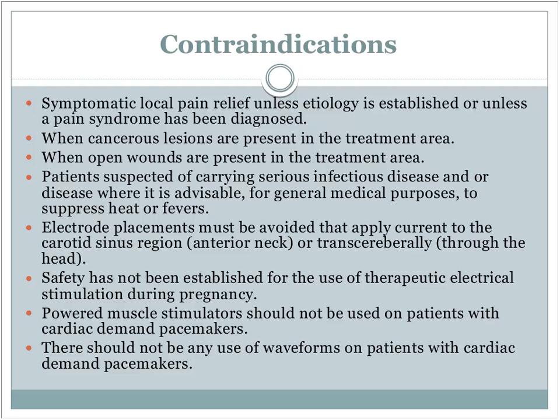Not someone who said, hey, can I get a therapist to come in and do TENS for me? Powered muscle stimulators on patients with cardiac demand pacemakers. So you don't want to be doing a lot of muscle stim for contraction when they have a cardiac demand pacemaker, because that can trigger the demand of the pacemaker and it will go off when it's not supposed to.